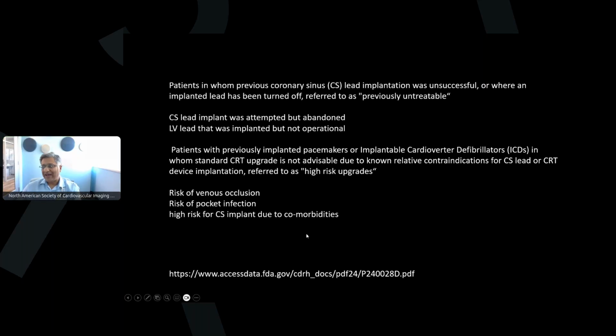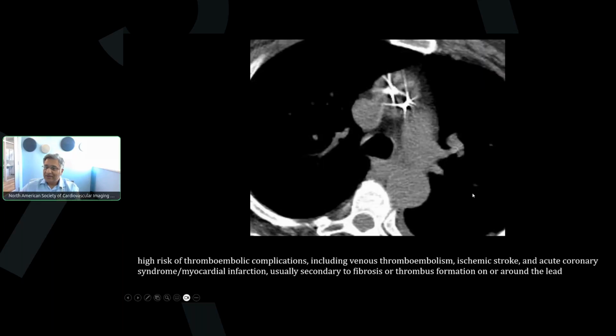because as we are constantly evolving these techniques, newer devices will come into play. And I think these web seminars are a great way to talk about this, anything new that we see in our practice. I agree. I saw this case originally in an X-ray, and I thought it was a fragment, like a foreign body initially. So it's interesting that we have to know these things because otherwise you start making the wrong calls. Great.